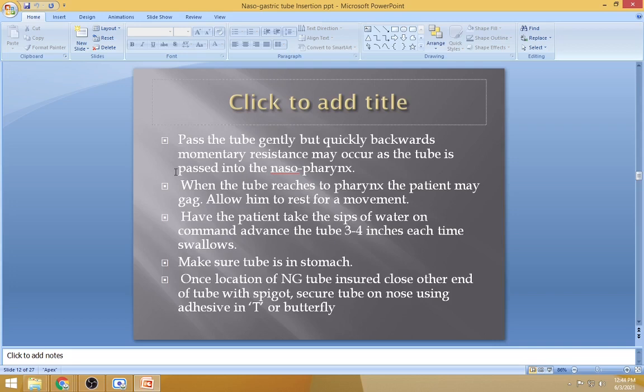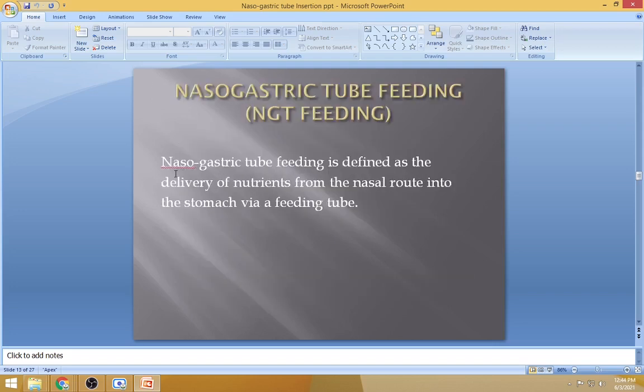Ma'am, it means air is present. So we first check whether the oxygen cylinder is empty or not. Then if the bubble comes out, that means oxygen is there and we can administer it to the patient during oxygenation. Now in your NG tube case, when you insert the tube in the water and if there are bubbles, that means there is something wrong. The NG tube is towards the lungs. If it's towards the lungs, it means oxygen leak will be there. Yes or no? Yes, ma'am.